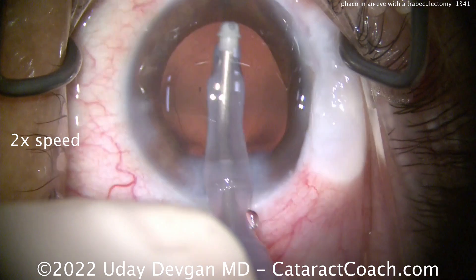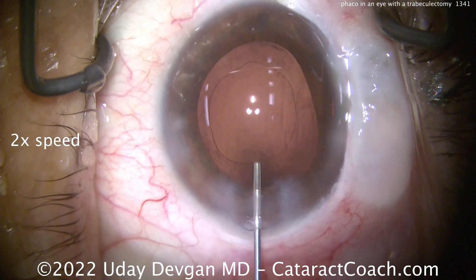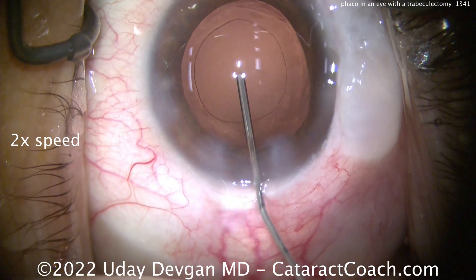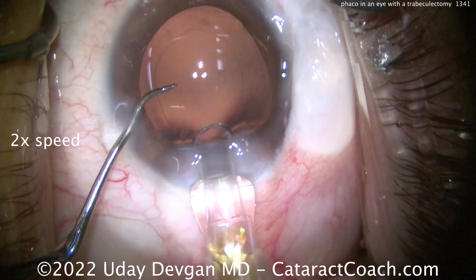Polishing up the capsule here, and looking at that bleb — it's pretty reasonable. Also be sure when you put in your speculum that it's not going to damage that bleb. The titanium blue arms are away from the area of the bleb. Here comes our lens — we're putting in a single-piece monofocal acrylic lens.